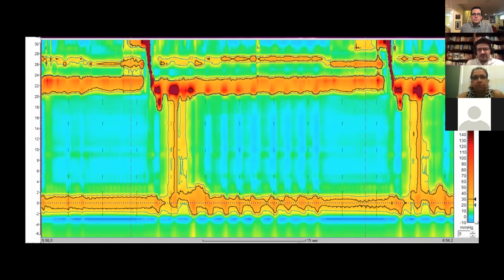And I think this is a good example of why you should get manometry beforehand, because what if you get a post-op manometry that looks like this and you didn't have one before, and now you're really in a bind. Like, does this patient have pseudo-achalasia from my wrap being too tight, or did he have achalasia to begin with, right? So to your question, Andy, again, a clinical chart and maybe look for normal peristalsis mixed in.